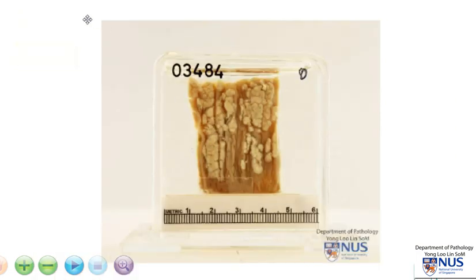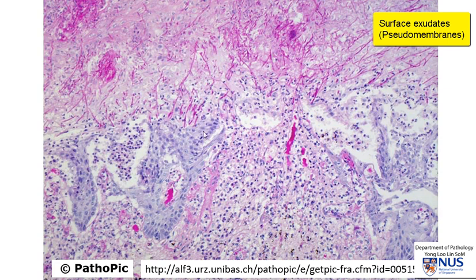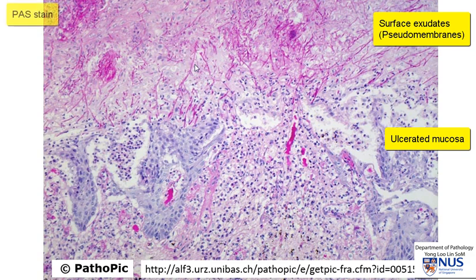Let's take a look at the microscopic appearance. This is a section taken from the mucosa. Here is the exudate over the mucosa — this corresponds to the pale yellowish pseudomembranes that we saw — and over here you have some ulcerated mucosa and there is some residual stratified squamous epithelium here.